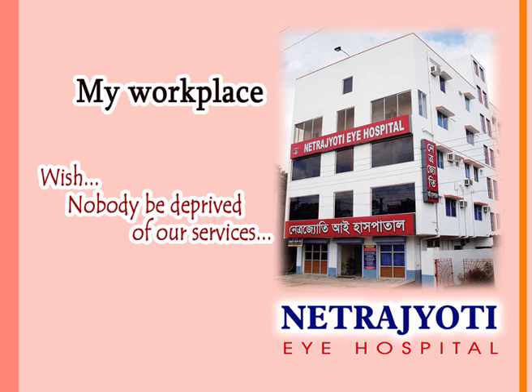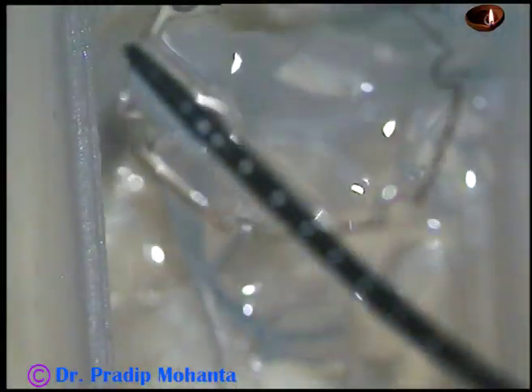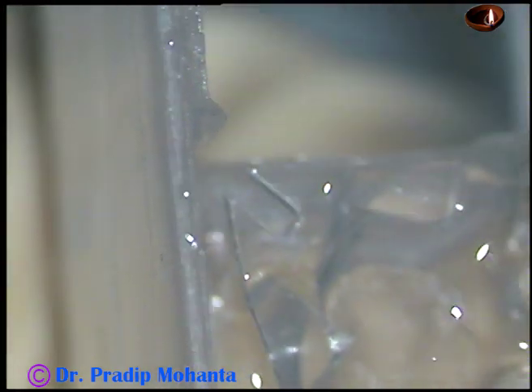Friends, welcome to my workplace at Ranaghat, West Bengal, India. This is a pupil expansion device known as B-hex. We will see how to apply this device and how to remove it in this case.